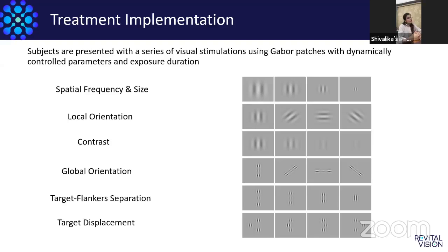So all of this is very much automated. We are not doing any changes ourselves in the program. Everything is taken care of by the algorithm itself, and whenever the patient is performing the task, everything will change based on the patient's each day performance.